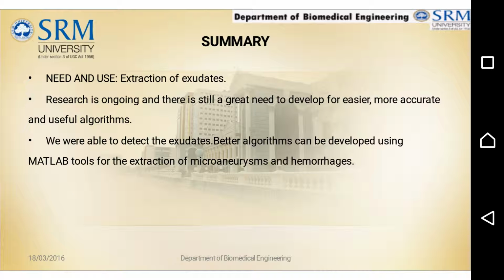Now let's talk about the software requirements. As this has the complete assistance of software, we use MATLAB 2015 here for the image processing. MATLAB is a scientific programming language and provides strong mathematical and numerical support for implementation of advanced algorithms. It is for this reason that MATLAB is widely used in the image processing and computer vision community. New algorithms are very likely to be implemented first in MATLAB. Indeed, they may only be available in MATLAB.